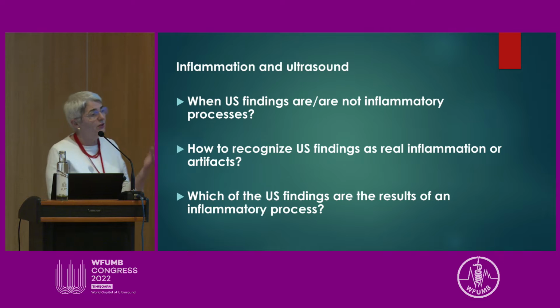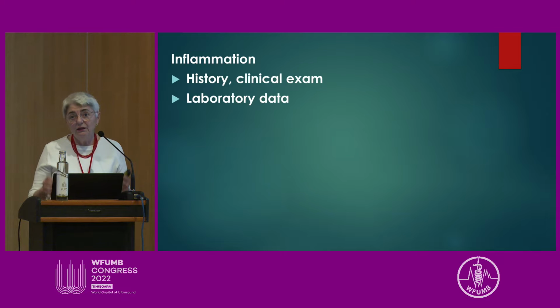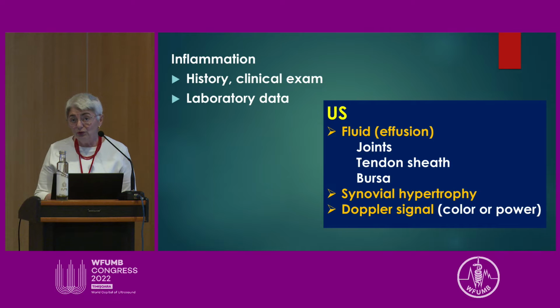I will try to answer this question: when ultrasound findings can be considered as inflammation or not, how to recognize the findings as real inflammation, and which of the ultrasound findings are the results of an inflammatory process. In fact, when we have a patient with a painful or swollen part of the body, it's very useful to start with some history, some clinical examination, and to have a few laboratory data. That will be very, very important for our judgment.